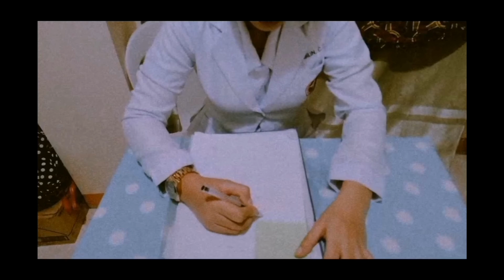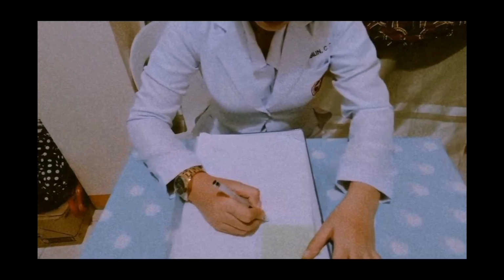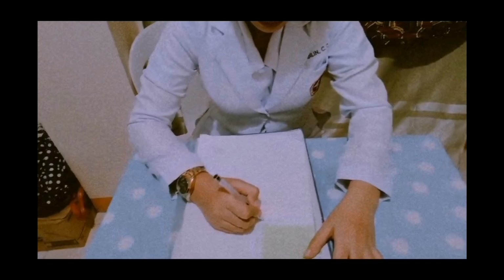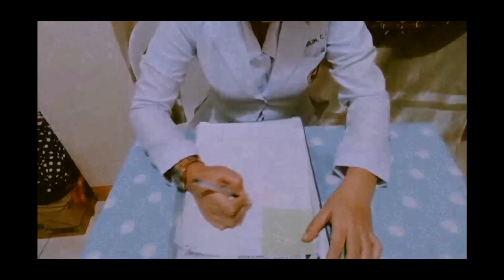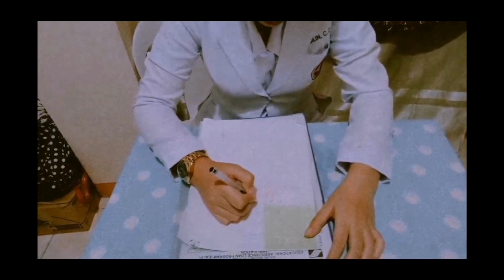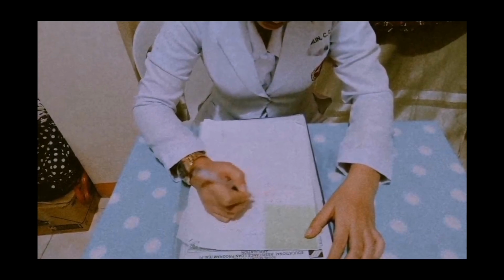And the last procedure is to record the amount of fluid infused on the I&O record sheet and on the chart if necessary. Include the type of solution used, time, and reason for discontinuing the infusion and the client's response. This ensures accurate documentation of client's response.